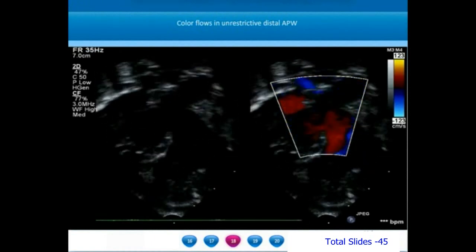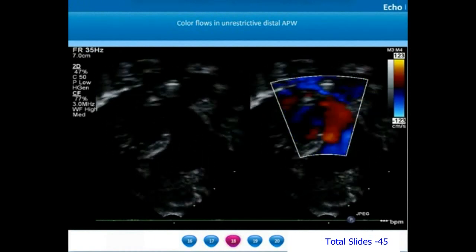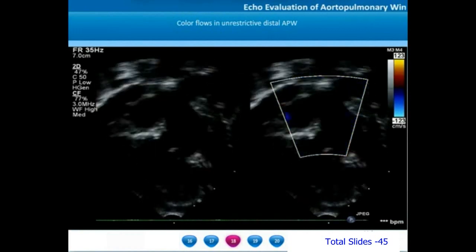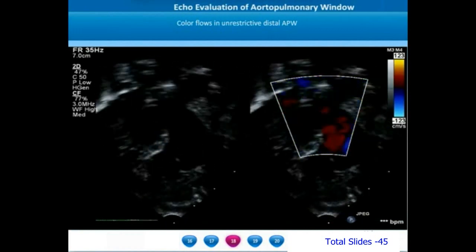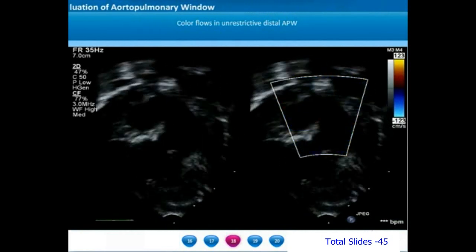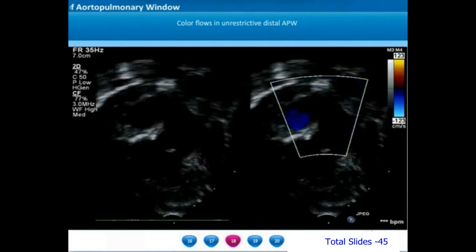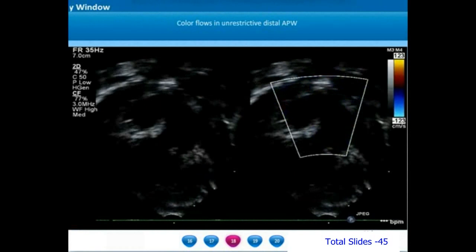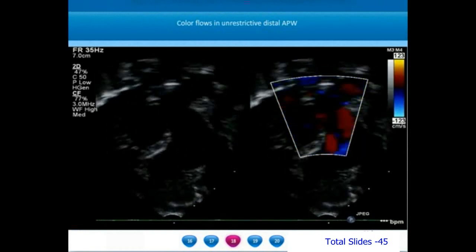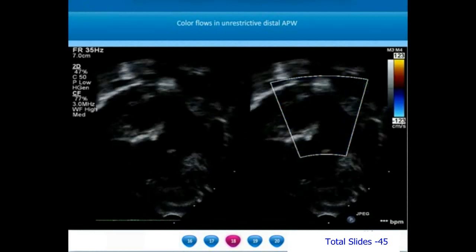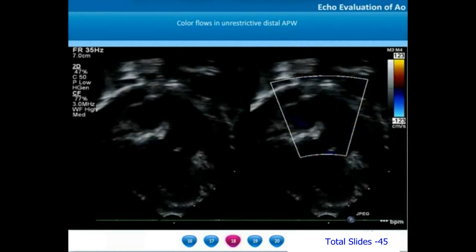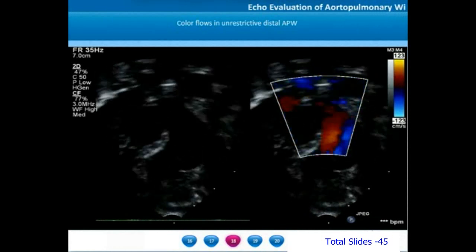On color compare mode in the same view, we appreciate the pulmonary valve and the main pulmonary artery. The proximal portion of the aortopulmonary septum is fairly intact, but there is a large distal aortopulmonary communication almost extending up to the pulmonary artery bifurcation. This is the characteristic feature of a distal AP window — by definition, distal aortopulmonary window should extend up to the pulmonary artery bifurcation.